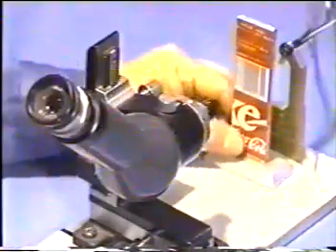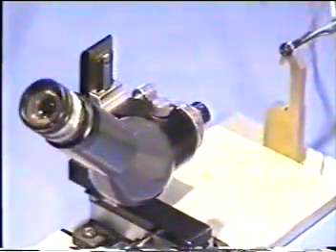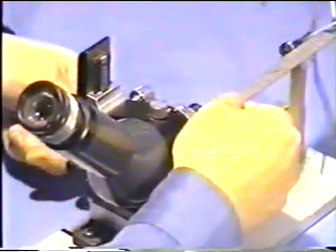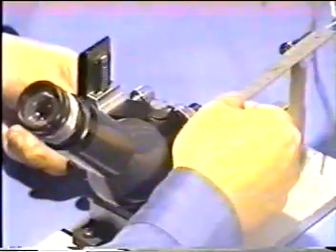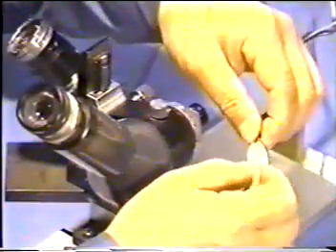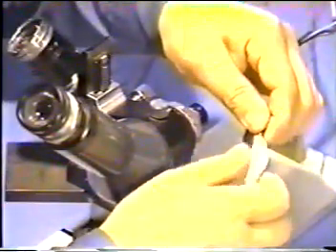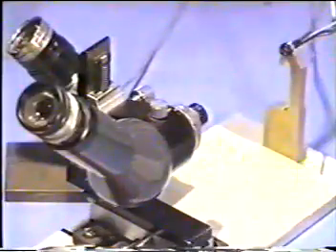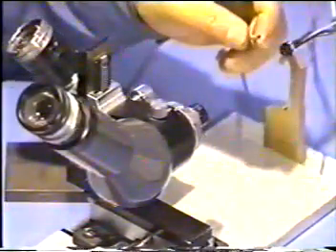Adjust tilt of the reticle of the microscope using the square gauge by observing the edge of it. The reticle center should be aligned temporarily to the fiducial mark of the IG mask. Clean again the objective lens for dirt and foreign matter. Clean IG as well.